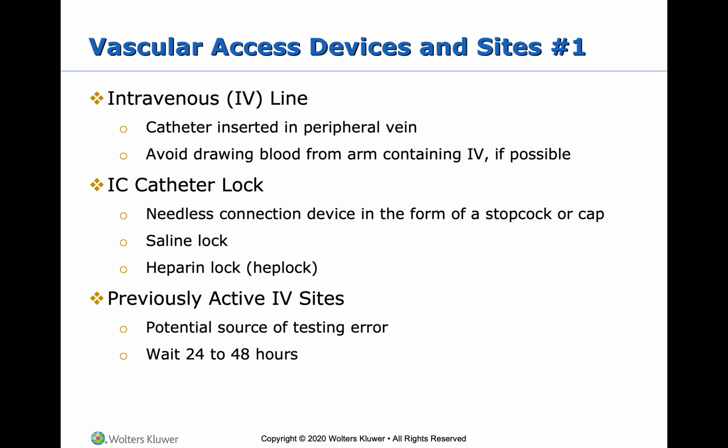Previously active IV sites. You're not going to want to draw from a previously active IV site, and this is because you don't necessarily know how long ago they removed that IV. There could still be some fluid or medication present in that site that could cause testing error.